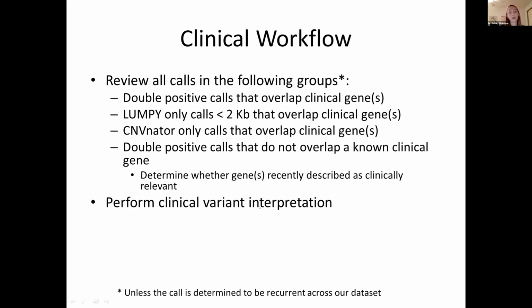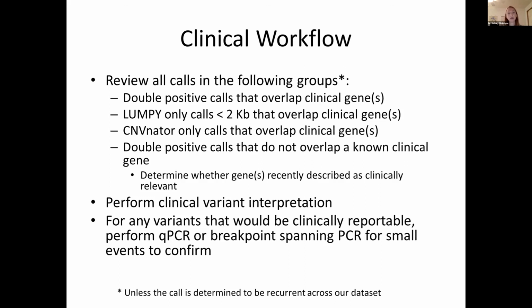Then perform clinical variant interpretation, which I won't get into here, but is really the time-consuming part of the bulk of this work. It is having our pathologists and our genetic counselors comb through databases and the literature, trying to find any evidence that these variants are significant or not. And then for any variants that would be reportable clinically, to perform qPCR or breakpoint spanning PCR to confirm them, and then go to the clinical report.